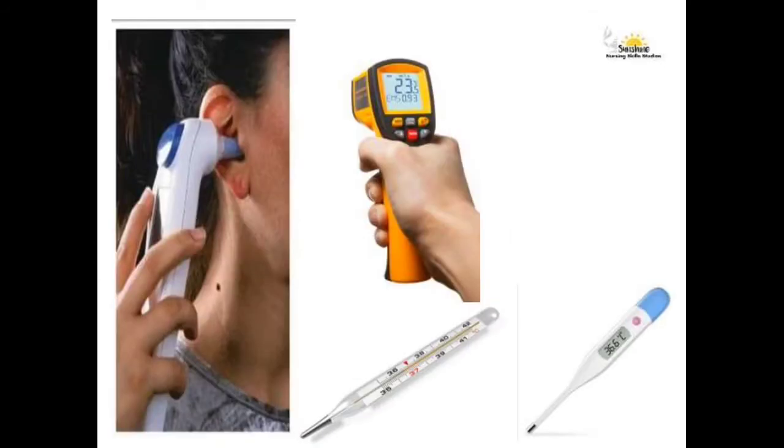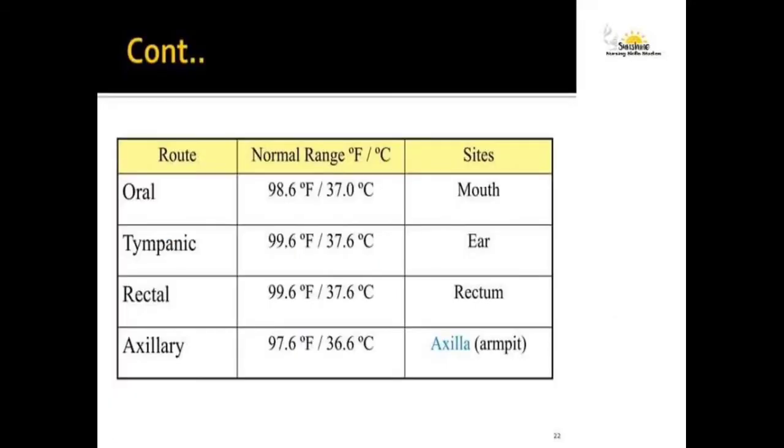Overall, to measure the body temperature, these are some of the commonest types of thermometers that we use in the hospitals. The normal temperature that we obtain through various routes is as follows.